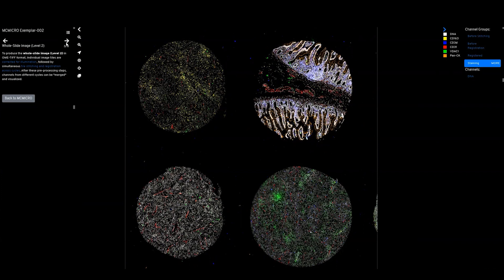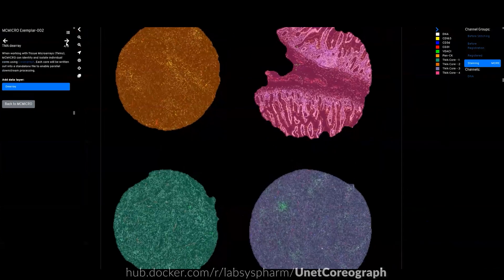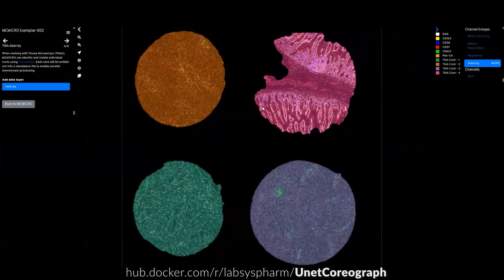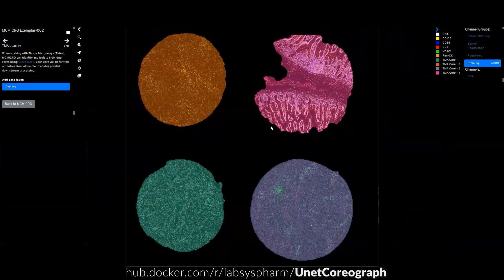An optional step for tissue microarrays is to split your cores into separate files for parallel processing.